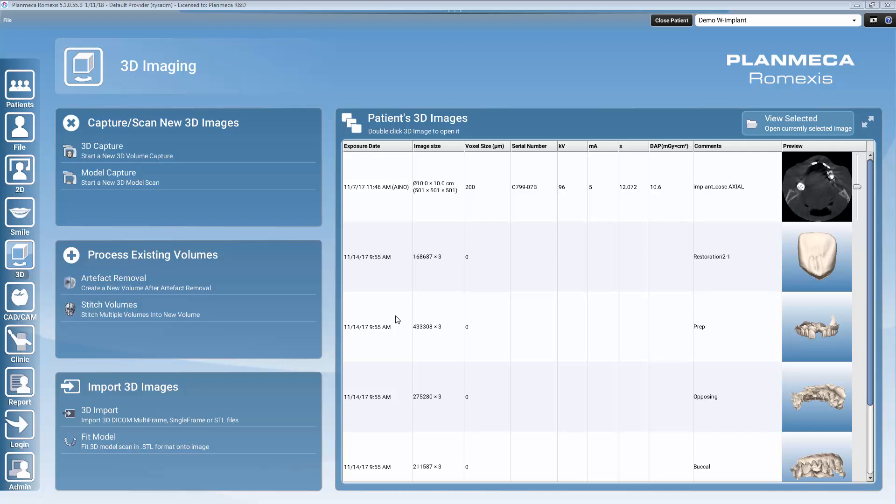Hello everybody and welcome to this Planmeca Romexis implant planning workflow video. In the next minutes I will be showing you how to do implant planning in Planmeca Romexis software and how to finalize it in your own designed implant guide that you can do even chair side.